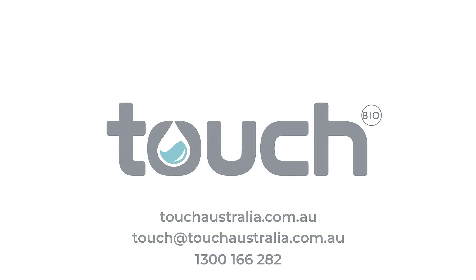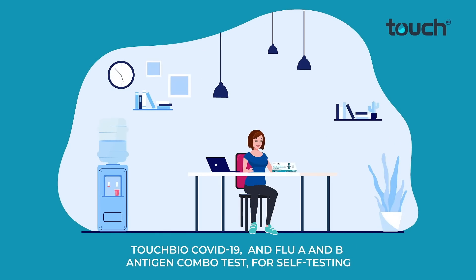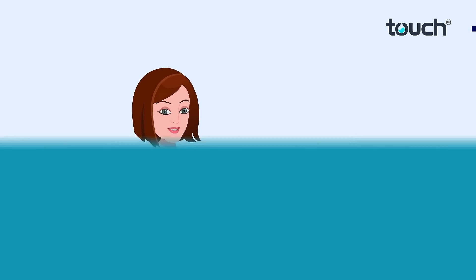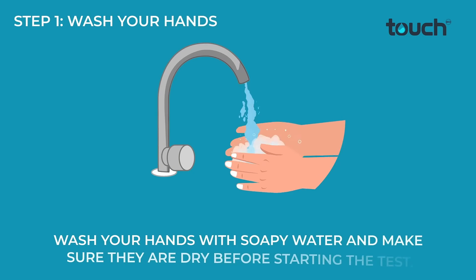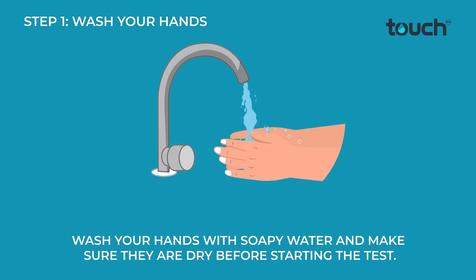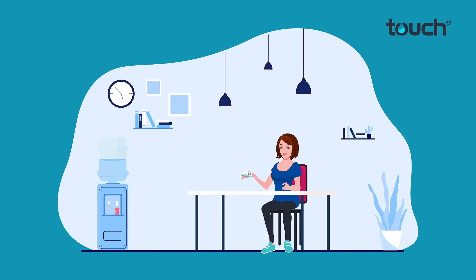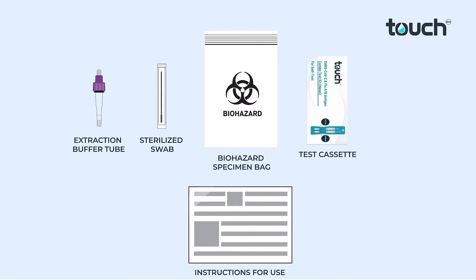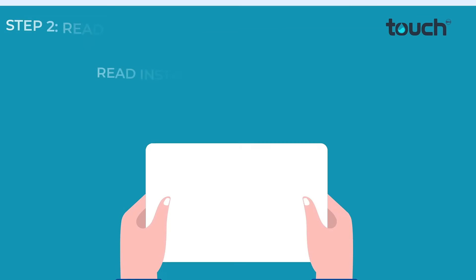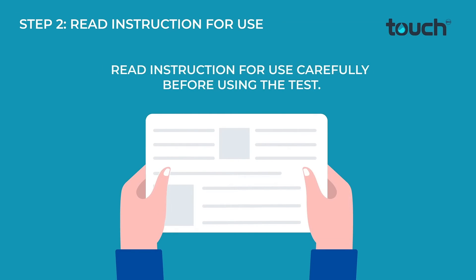Touch Bio COVID-19 and Flu A and B Antigen Combo Test for self-testing. Wash your hands with soapy water and make sure they are dry before starting the test. Open the box and check the components before use. Read the instructions for use carefully before using the test.